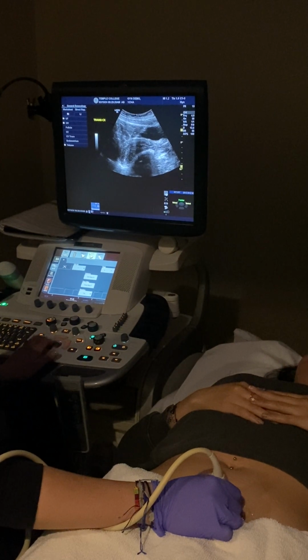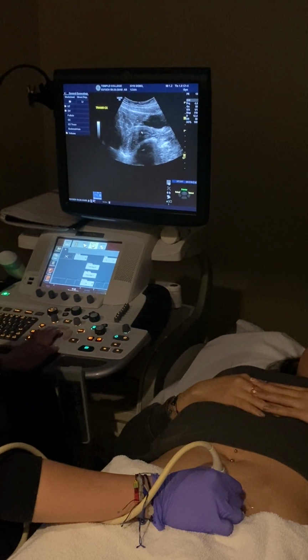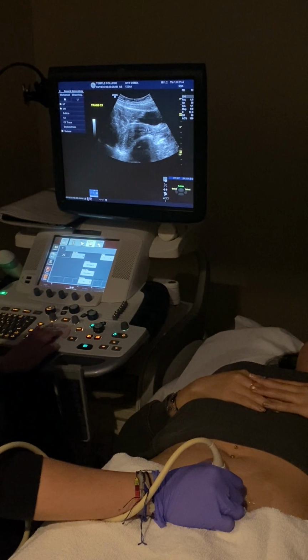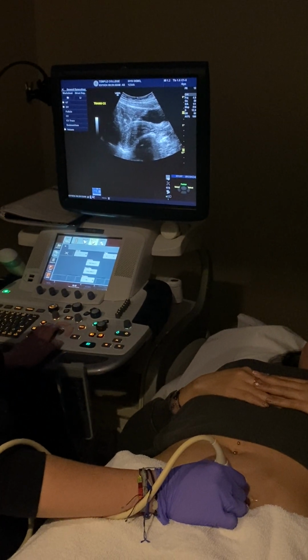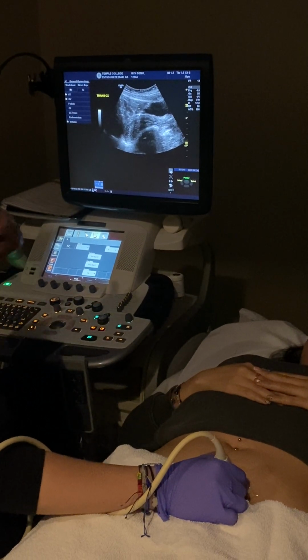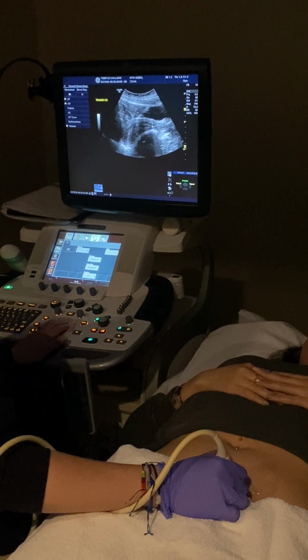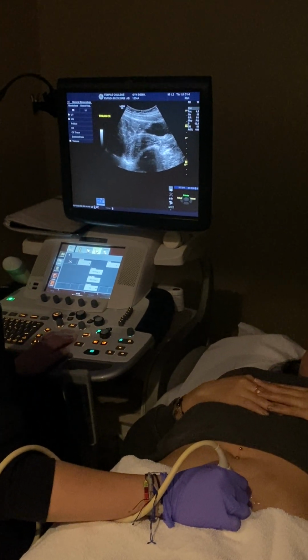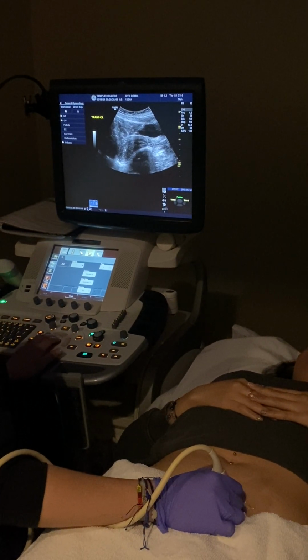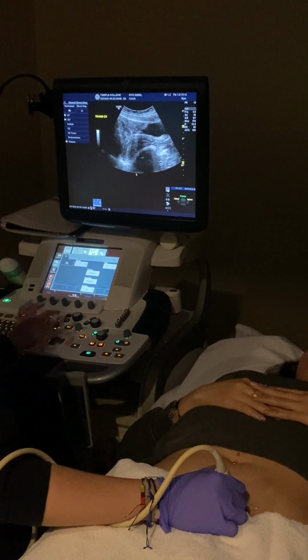So her uterus points posteriorly. That is why it's retroverted. If her cervix came up like this, and then her uterus bent back, that is retroflexed. And anteflexed is where it comes up like this. That's the typical presentation. We're not going to say normal because her uterus is still normal. It's just how it's laying in her body, okay? So, external os leading into vaginal canal, cervix, internal os, endometrial canal. This whole structure is her uterus, and it's her uterus in midline.